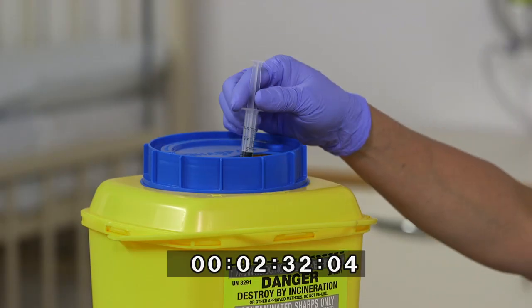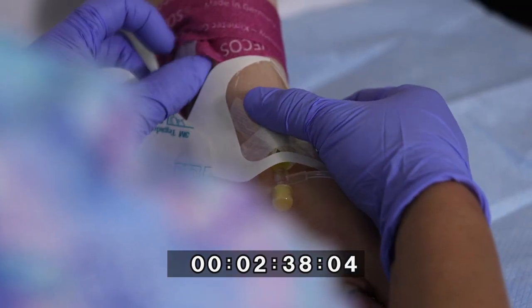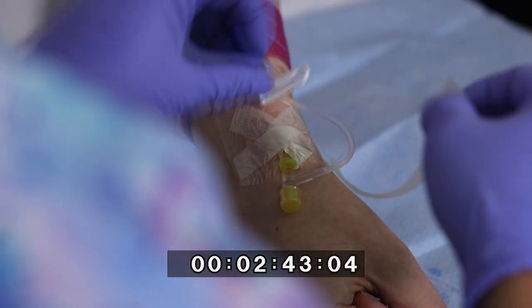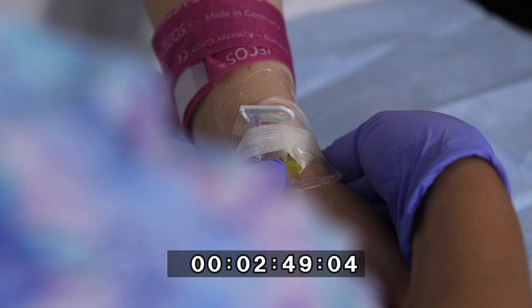She disconnects the syringe. She secures and anchors the IV cannula further with a sterile transparent semi-permeable dressing. She loops the T connector tubing and secures. Further securement of the IV cannula may be necessary and is dependent on local policies. She removes the tourniquet.